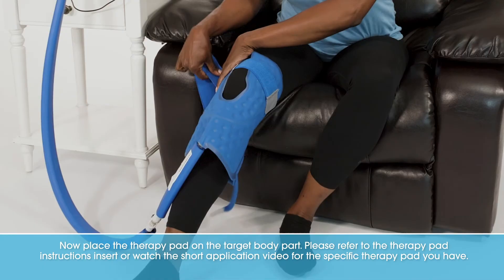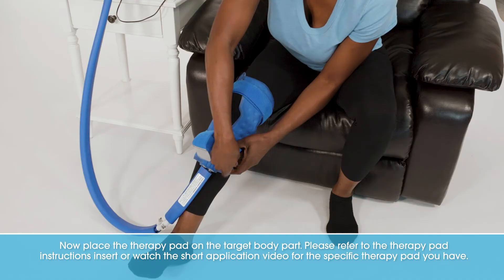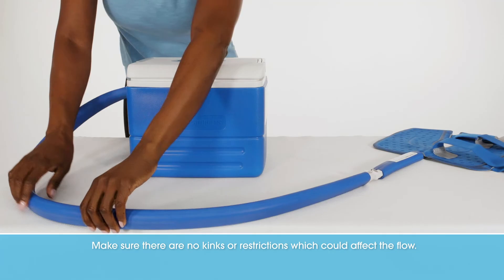Now, place the therapy pad on the target body part. Please refer to the therapy pad instructions insert or watch the short application video for the specific therapy pad you have. Inside the cooling reservoir, check the water return flow tube to confirm that water is flowing. Make sure there are no kinks or restrictions which could affect the flow.